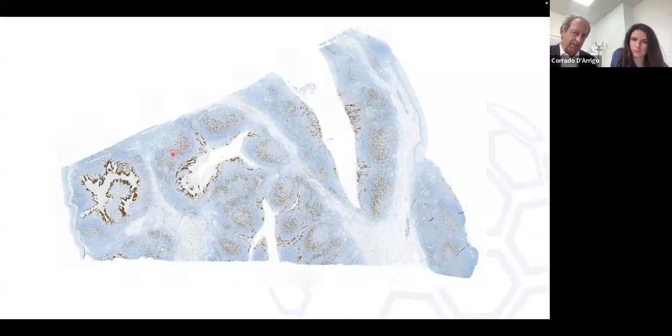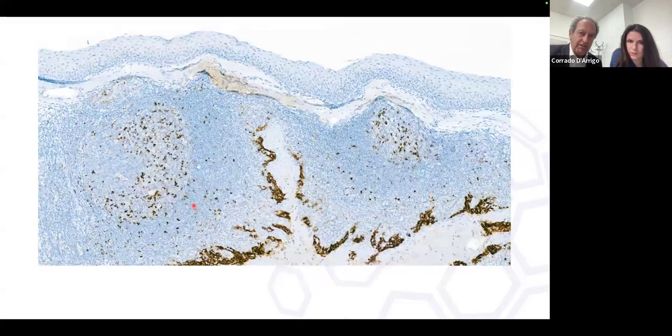These are germinal centers. What you see here are the tingible body macrophages predominantly. These are the interdigitated dendritic cells within the crypt epithelium. Here you see the surface squamous epithelium. That's negative, and there's a lot of negative areas. And these are the interfollicular areas with lymphocytes. I hope I have higher power. Yeah, there it is. You saw negative surface epithelium, crypt epithelium.